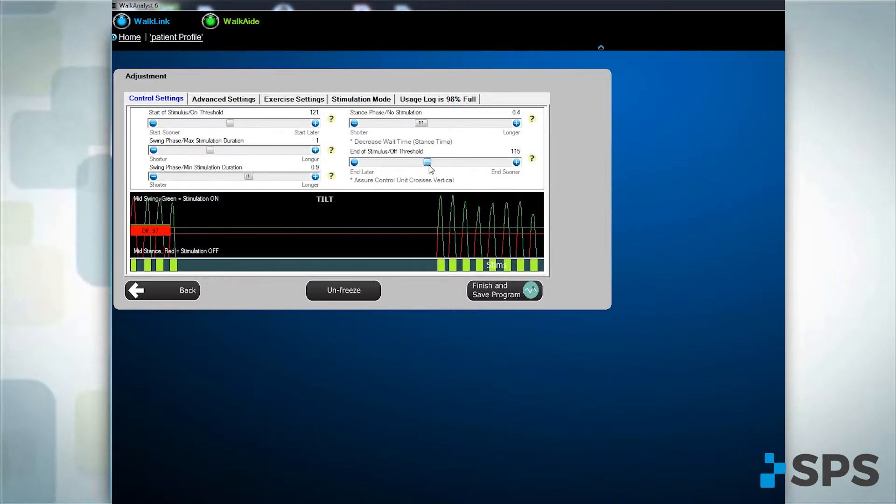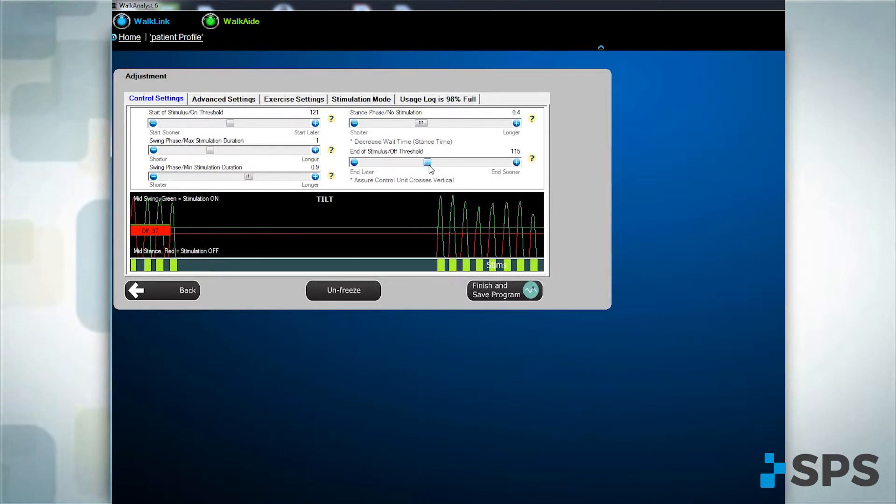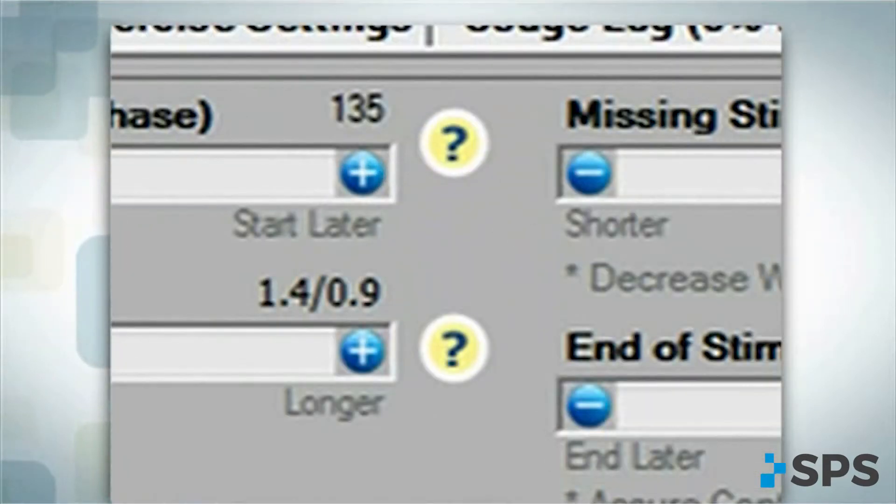For explanations about the adjustment options or how to make specific adjustments to stimulation timing, move your cursor over the yellow question mark next to the option.